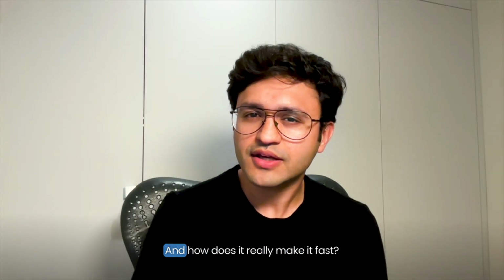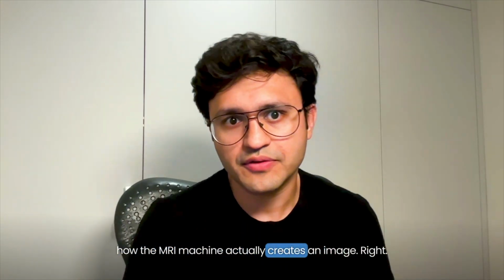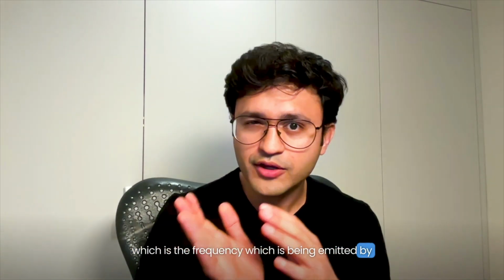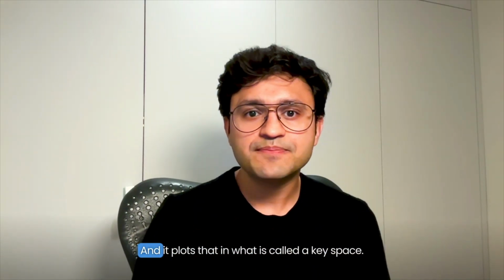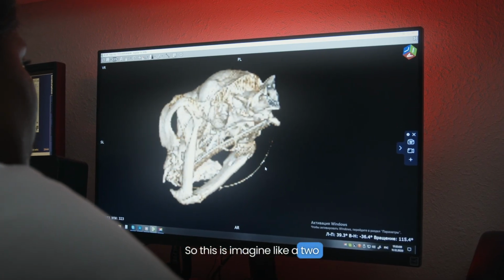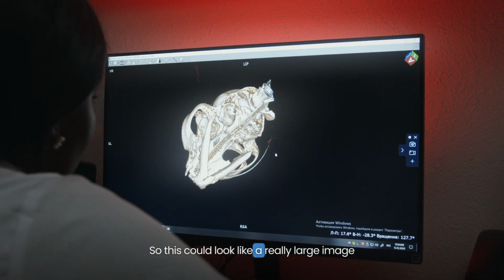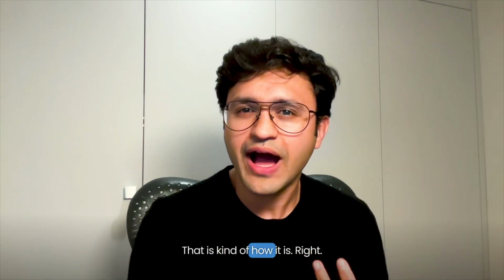But how does that really work and how does it really make it fast? So to answer that question, let's first understand how the MRI machine actually creates an image, right? So a normal MRI machine basically collects raw data, which is the frequency which is being emitted by all those hydrogen atom movement, the radio waves which was being emitted, as I was telling you about, right? And it plots that in what is called a K-space. So this is, imagine like a 2-dimensional or a 3-dimensional large space, and then you do a spatial frequency mapping, right? So this could look like a really large image, and each pixel is what you start collecting. That is kind of how it is, right?